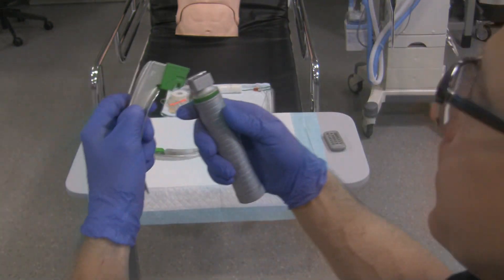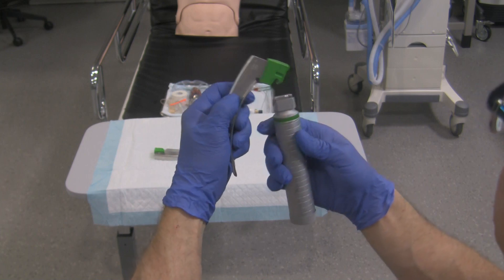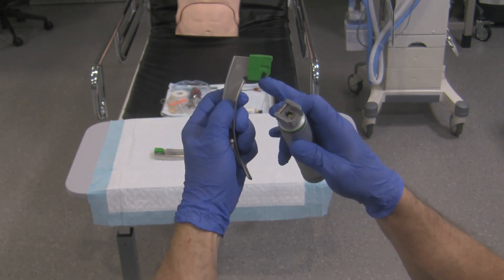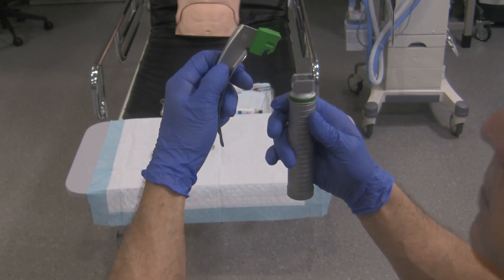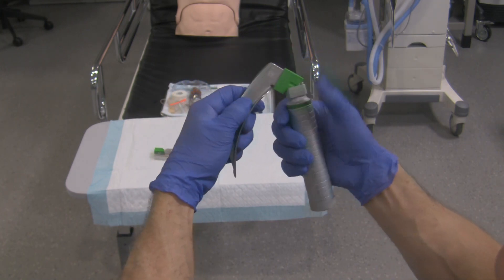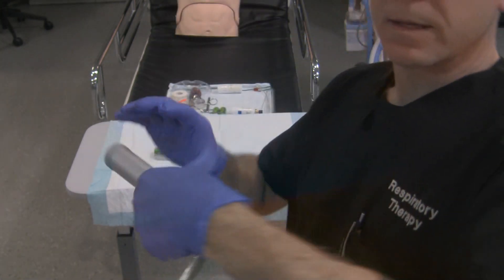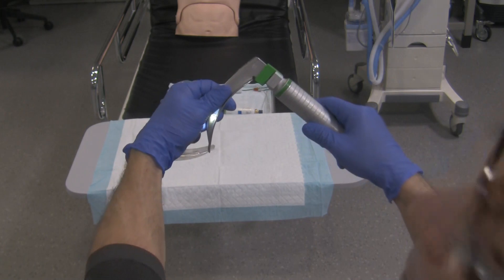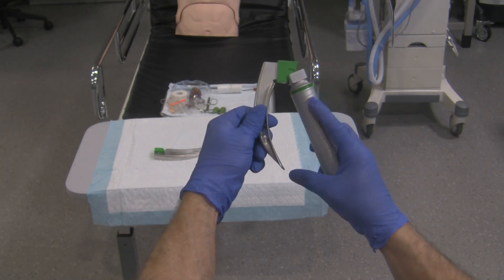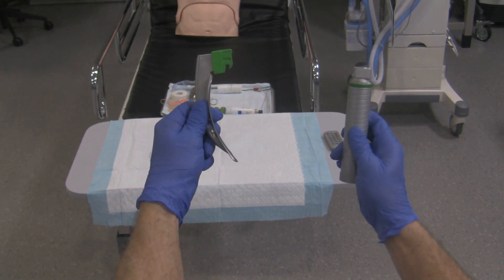I'm going to reverse this — line it up, and I've got it lined up. The slot of the blade goes into the bar of the handle. Line them up like so, push down and lock it in place — it's good to go. To take it off, same thing: close the blade, push off with your thumb, and it comes apart quite easily.